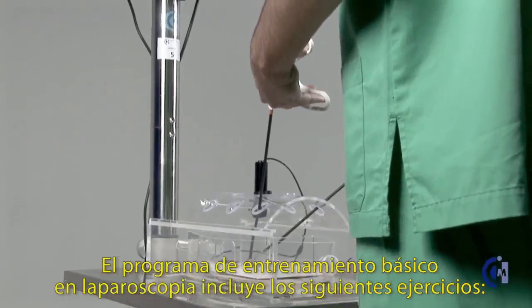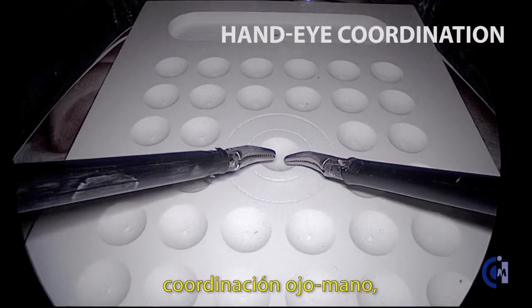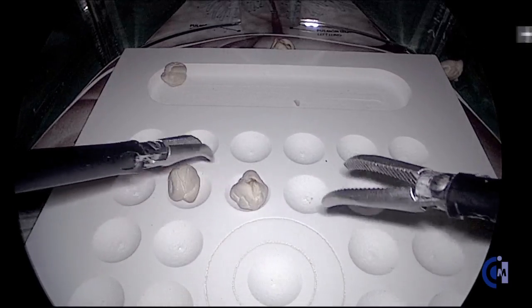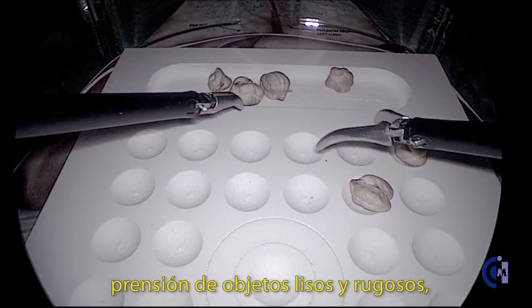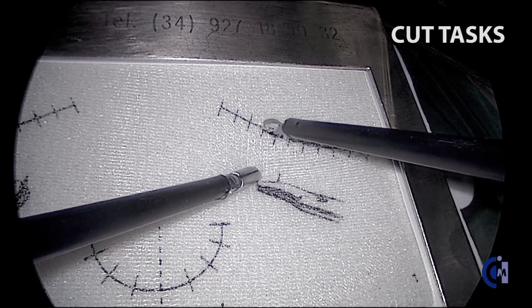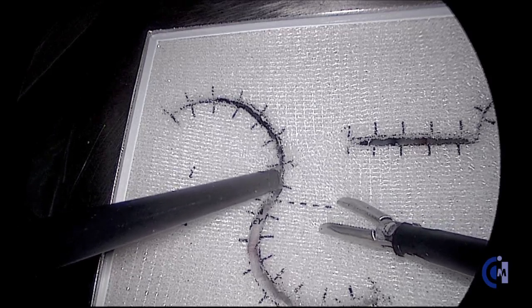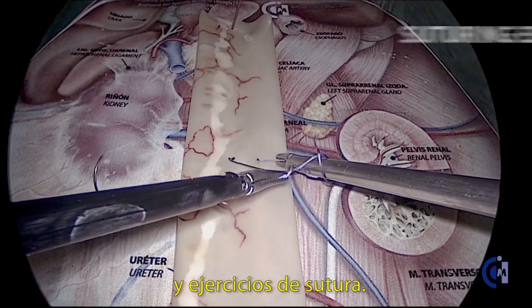The basic training program on laparoscopy includes the following tasks: hand-eye coordination, hand-hand coordination, grasping and pick-and-place of smooth and rough objects, cut tasks on specific templates, and suturing exercises.